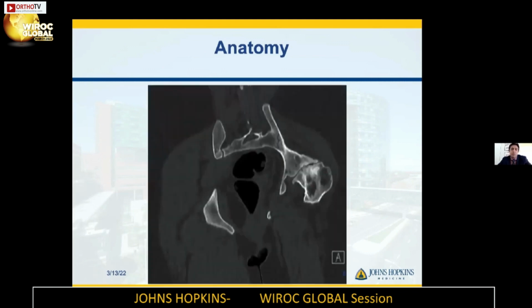This is a frontal reconstruction where we can see a lot of cystic changes in the femoral head and in the acetabulum. We can also see that robust shelf osteotomy that we want to try and preserve, as that can help us contain our hip reconstruction. We also see a teardrop right there at the bottom, which is our target for our center of rotation restoration for our hip implantation.